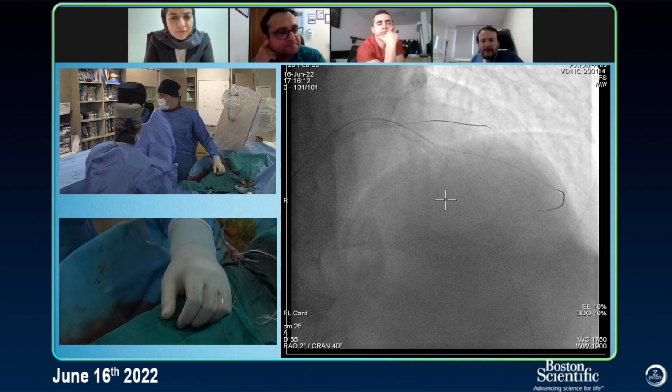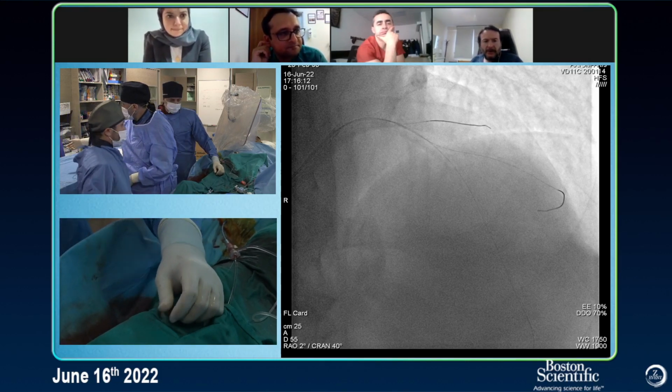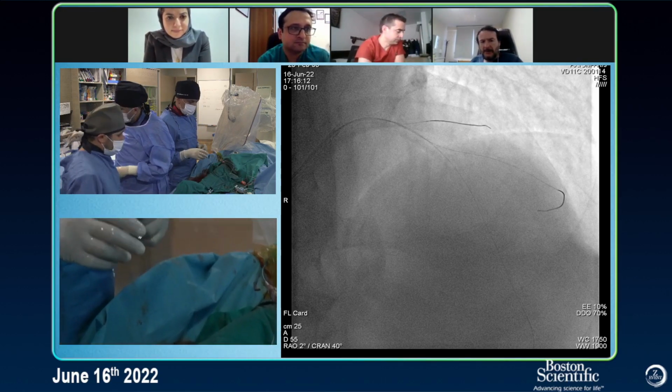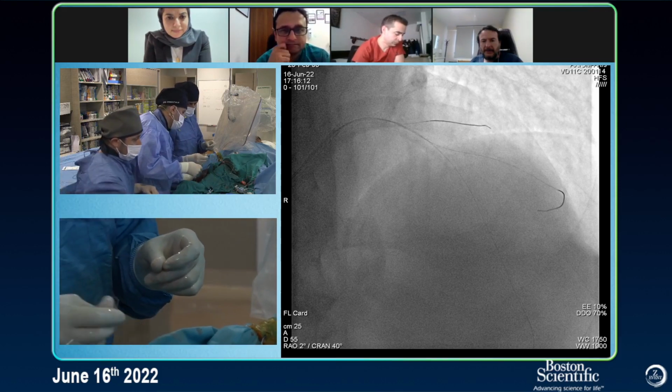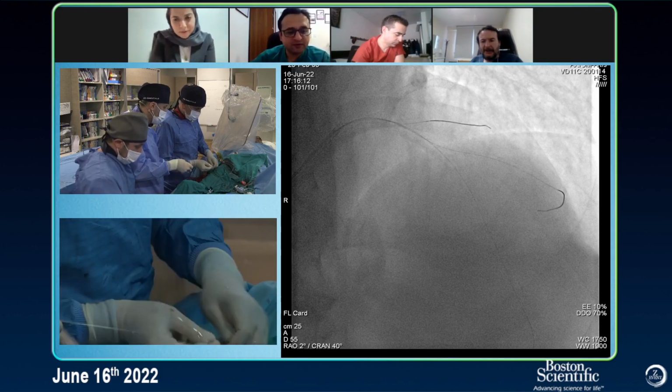If you put all of this to the calcium... It's big diagonal, huh? It is, yeah. Large, like a territory. A 2.75 or 3. Yeah, of course.